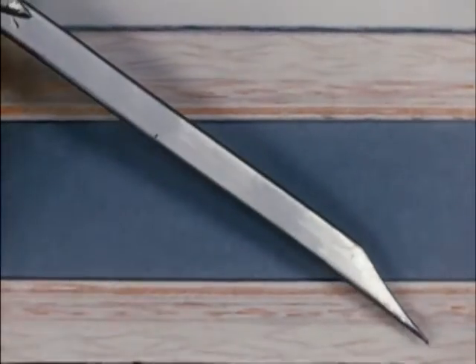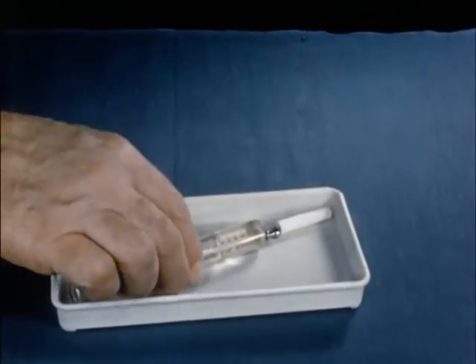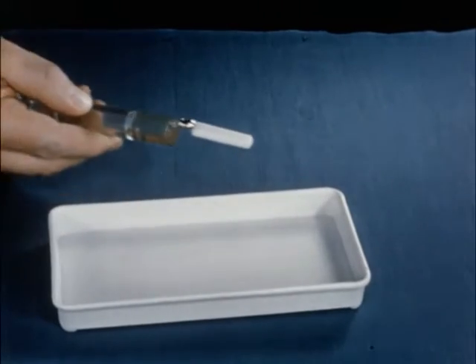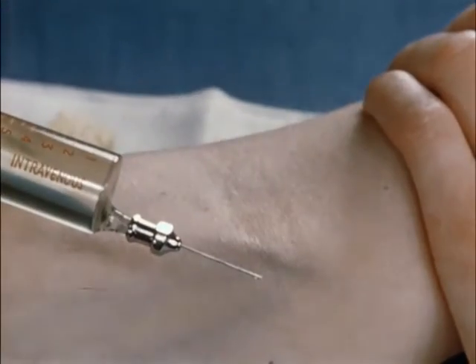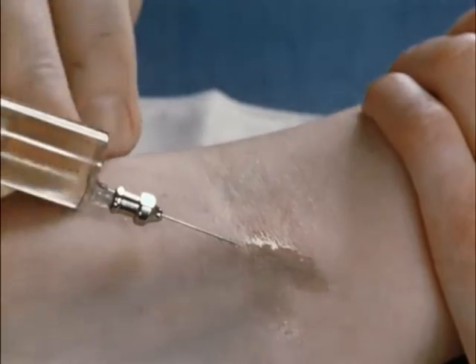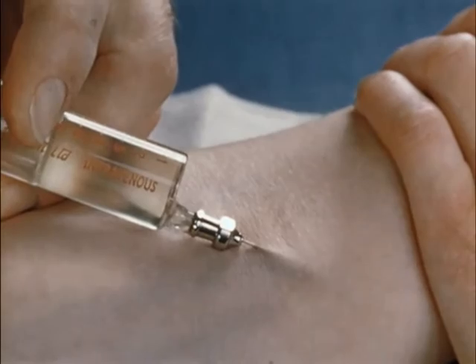Bevel up. Bevel down. When fitting the intravenous needle to the syringe, it is most important that it be given an extra half-turn to avoid risk of dislodgement during injection. In this instance, the precaution was omitted. The operator does not know that the needle is not firmly fixed. It is not dislodged by removing the cotton roll, making the venipuncture, or withdrawing blood. However, as soon as the injection commences, the needle is dislodged, the solution and blood spill out, the anaesthesia is interrupted, the patient disturbed, and much embarrassment caused.